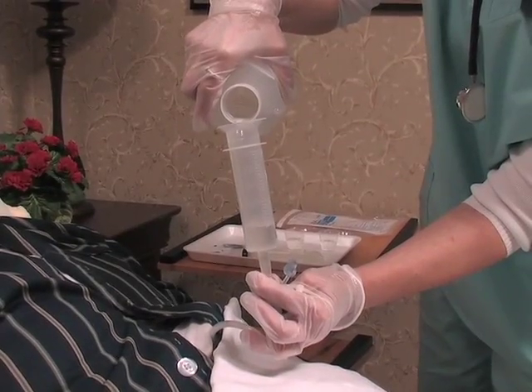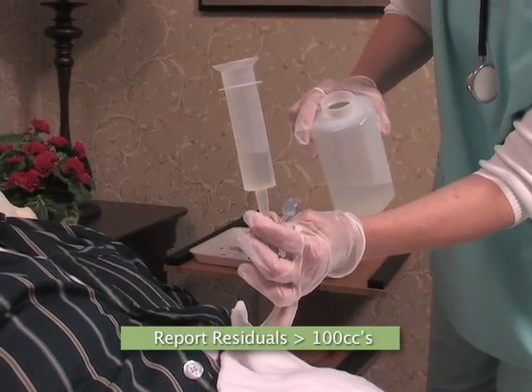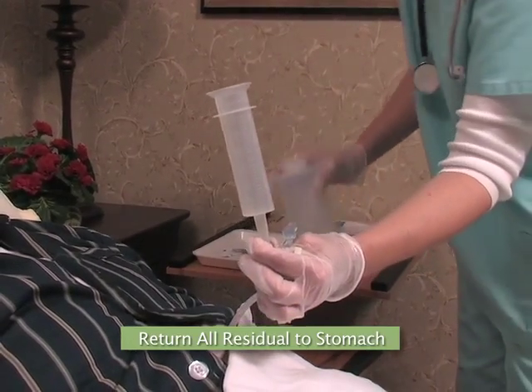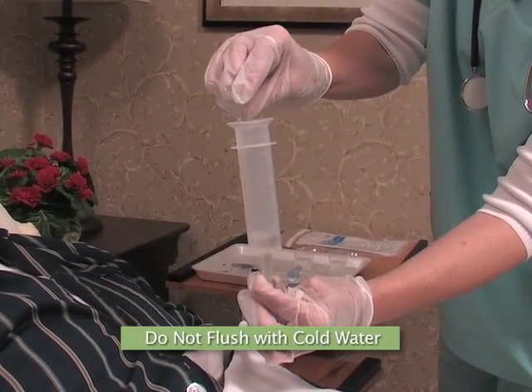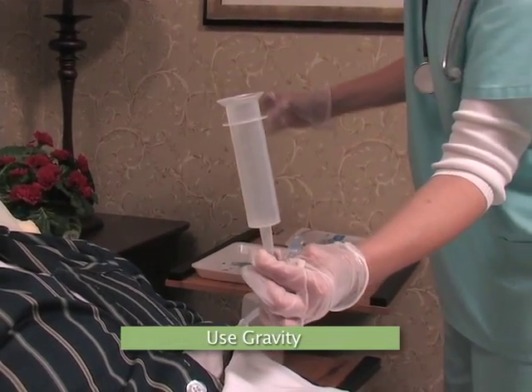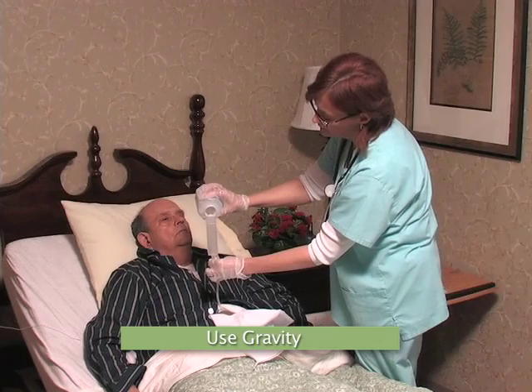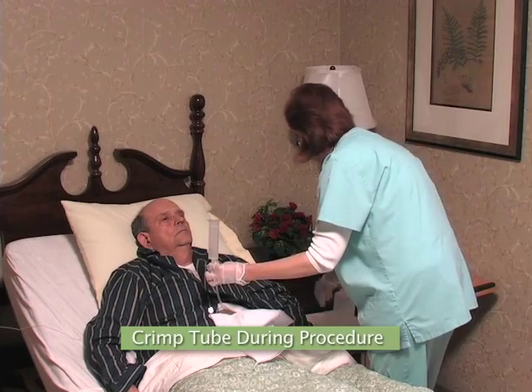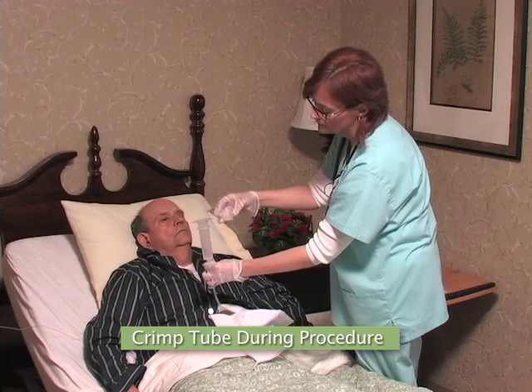Some other key points relating to G-tubes. Report residuals greater than 100 cc's to the physician after stopping the feeding. Return all residual back into the stomach. Cold water used for flushes can cause abdominal cramping, especially in the elderly population. Always use warm water. Never force any medication or fluid in the tube. Allow gravity to work. Crimp the tube while flushing to prevent water from flowing in the stomach too quickly. Keep the introduction of fluids at a slow and steady pace.